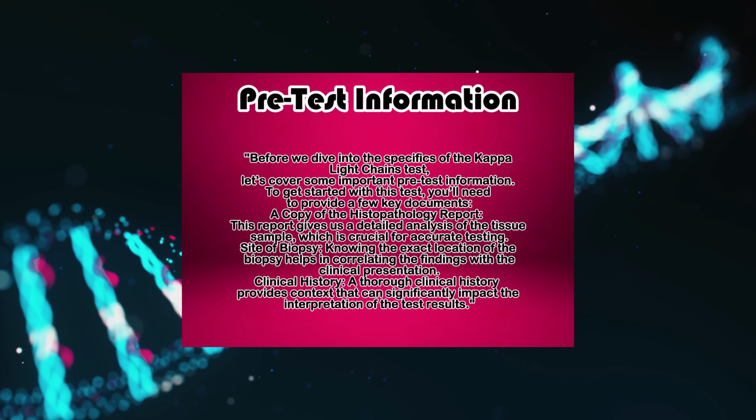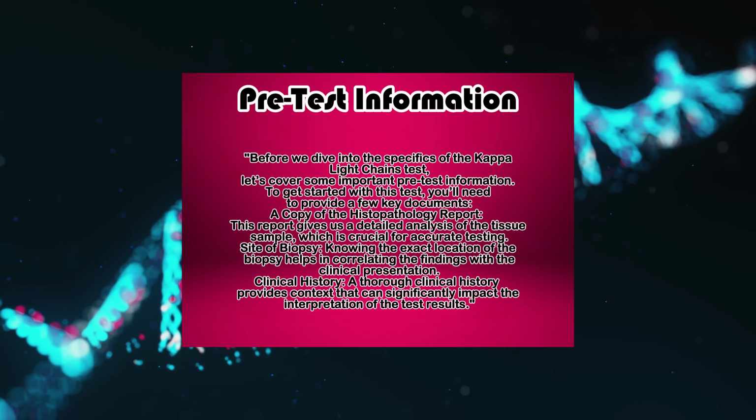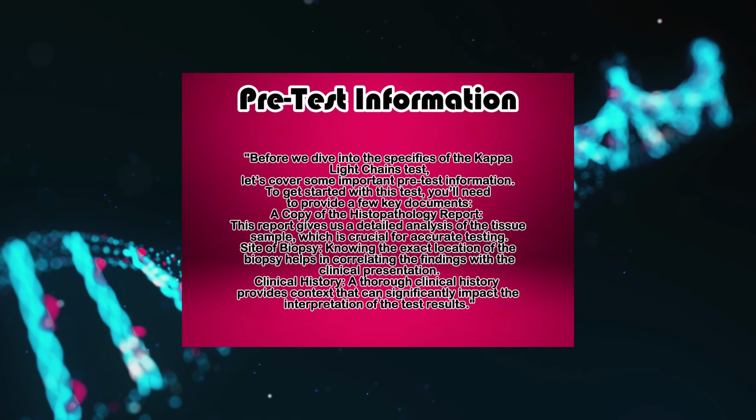pre-test information. To get started with this test, you'll need to provide a few key documents. A copy of the histopathology report. This report gives us a detailed analysis of the tissue sample, which is crucial for accurate testing.